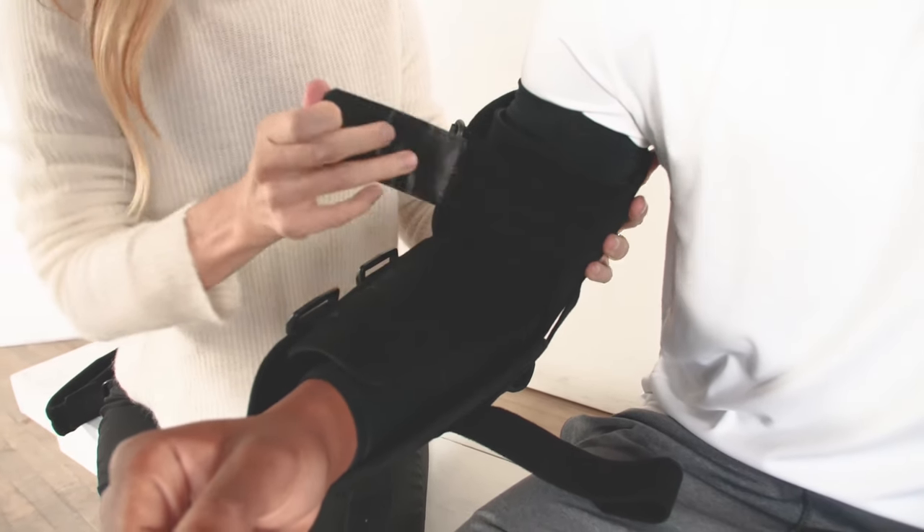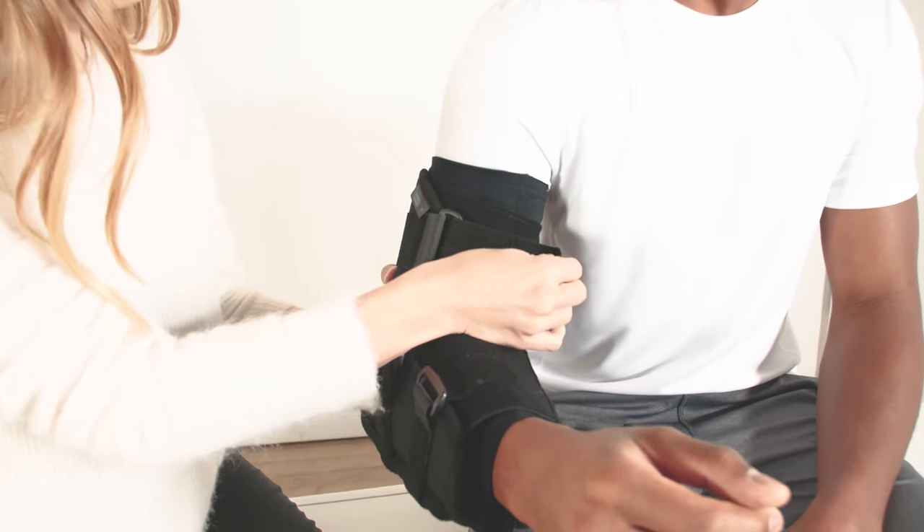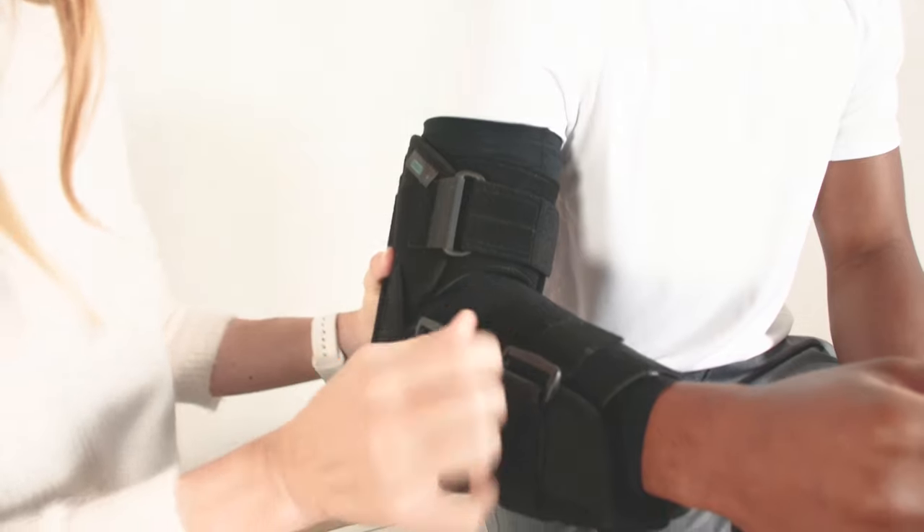I'm going to start by closing each strap. I want to make sure that the cuffs are tight but I'm not pinching his skin.